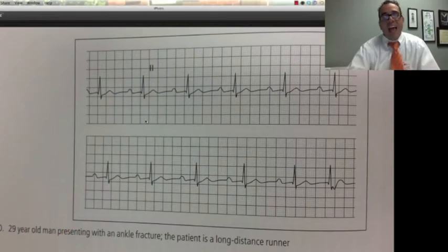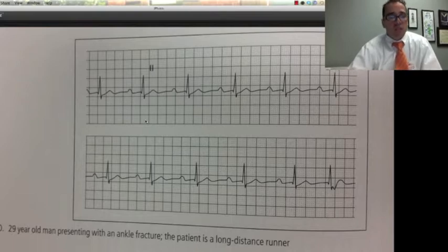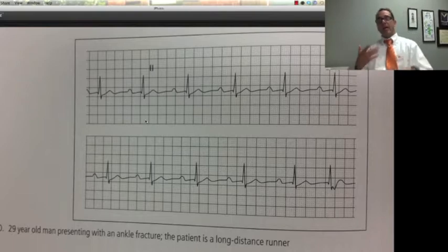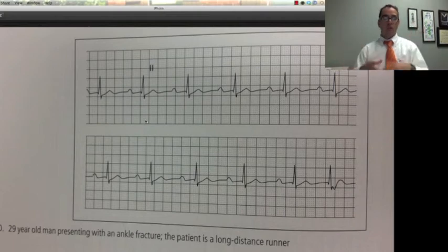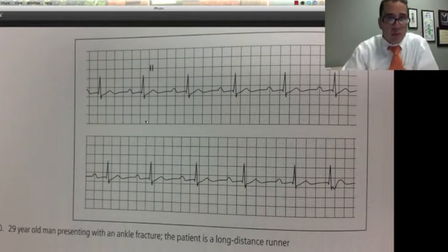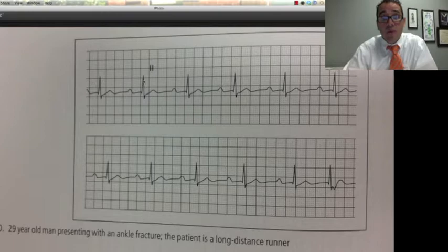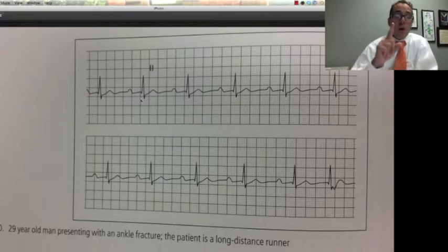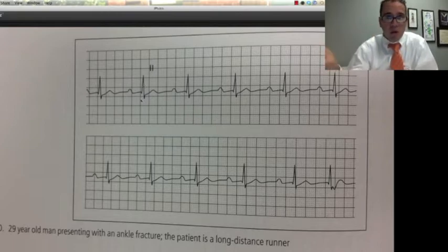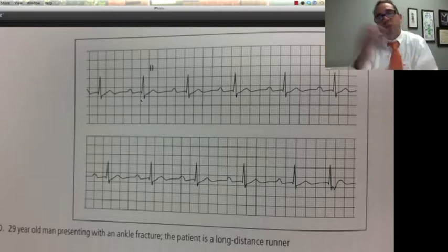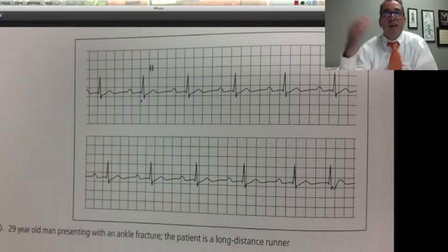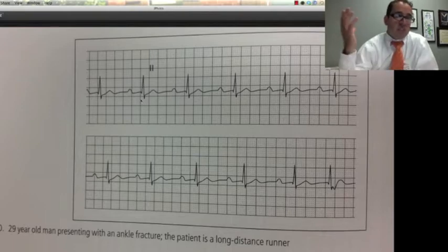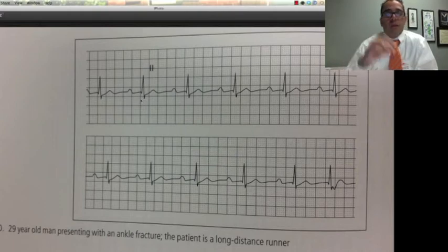29-year-old man presenting with ankle fracture. The patient is a long-distance runner. People who run and exercise a lot have a slower than average heart rate. You can see that the P takes a long time for the QRS to take place — that's called a first degree AV block. There's really no major significance to that for ER purposes. It's an incidental finding, not a big deal.